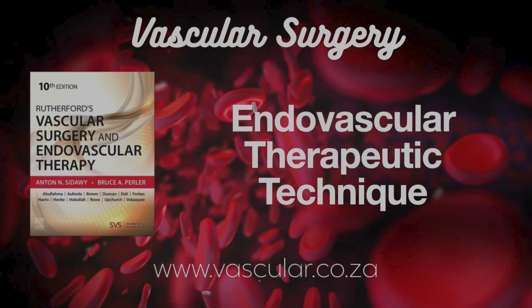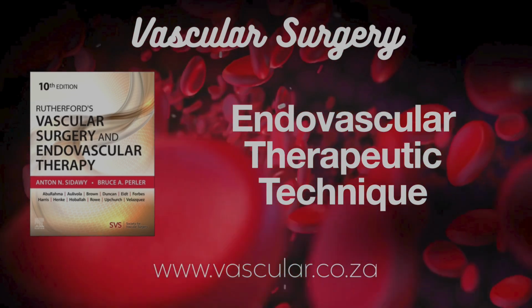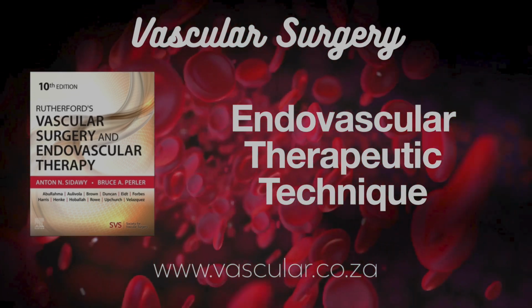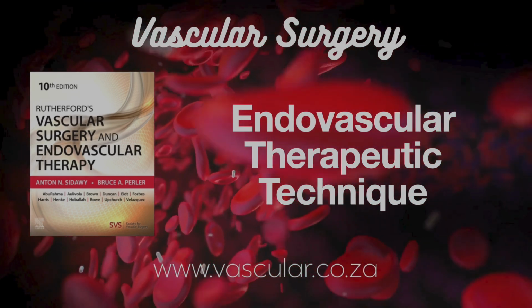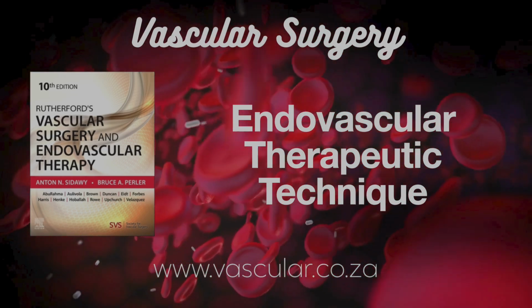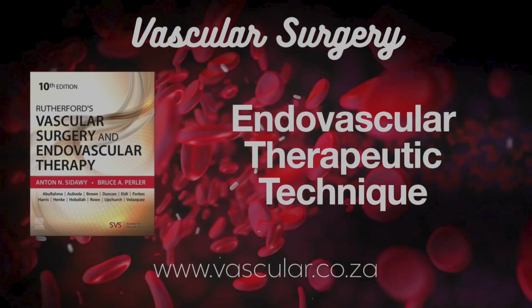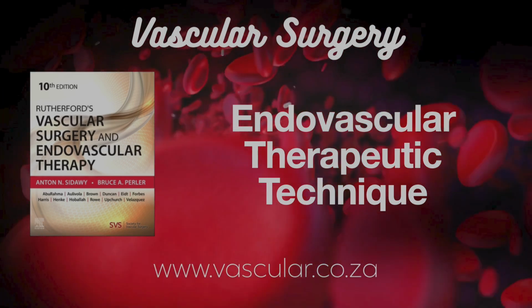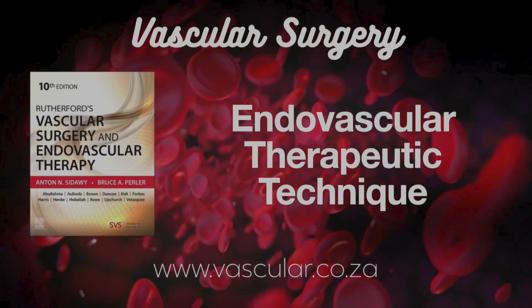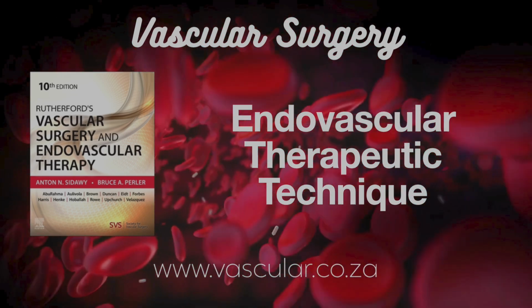They sound more like surgical closure. That's the idea. ProGlide and ProStar XL aim to mechanically close the hole with sutures. ProGlide deploys sutures on either side, tied externally, which mimics a surgical stitch. Big advantage: theoretically, no limit on reaccessing the site later or on anticoagulation. Used for 5 to 21 French holes, often multiple devices for 8 French and up, very common in EVAR and TAVR using the Perclose pre-closure technique. And ProStar XL, specifically for large bore, 8.5 to 10 French.